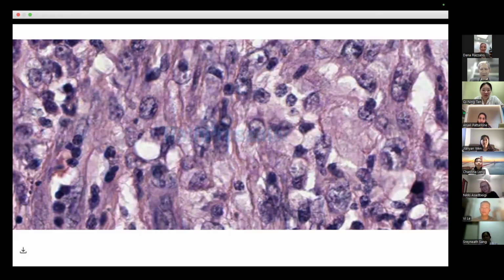Yeah. Thank you. Just to clarify for some of the students there, with immunohistochemical stains, at least in our systems, you can use either a brown chromogen or a red chromogen. And as we talk about the melanocytic lesions, that's where the brown of the melanocytes can interfere with the usual brown chromogen that we use for most immunoperoxidase.